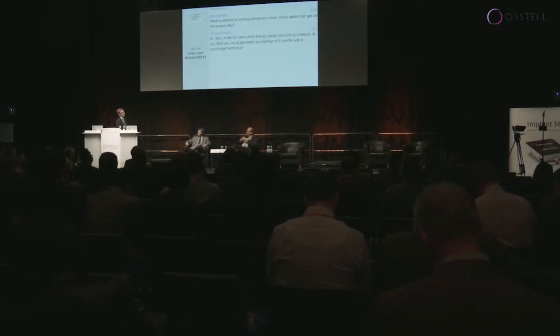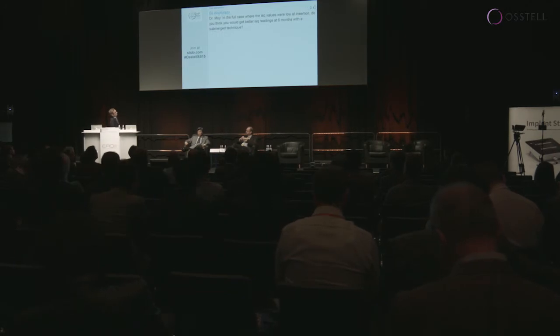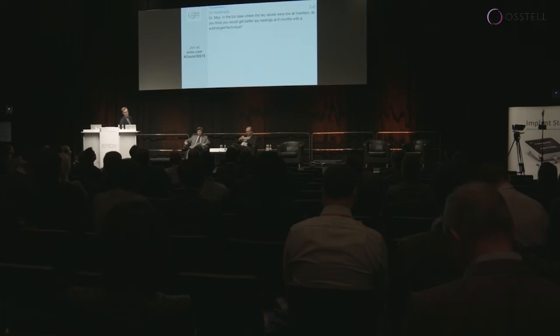Okay, so let's focus a little bit on more edentulous cases then. Here's a question for you, Dr. Moy. In the full arch case where the ISQ values were low at insertion, do you think you would get better ISQ readings at 6 months with the submerged technique? The answer is yes, absolutely.